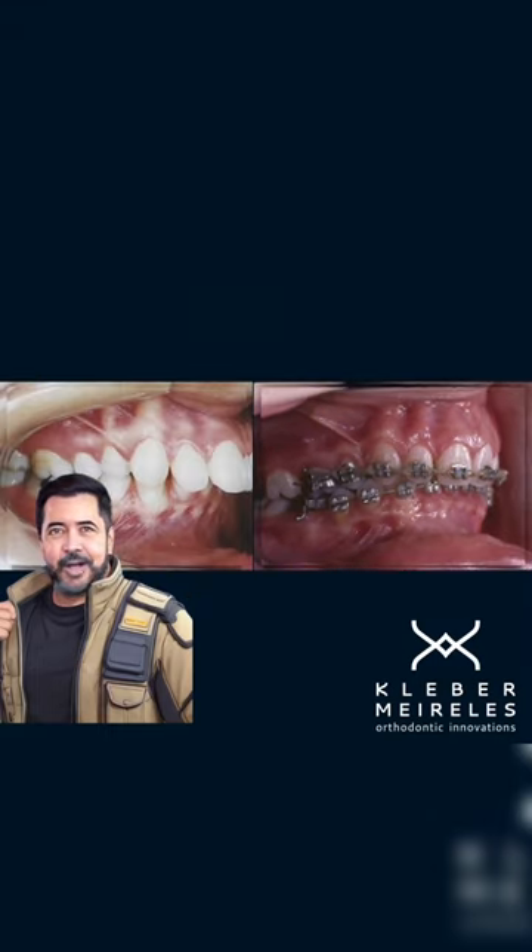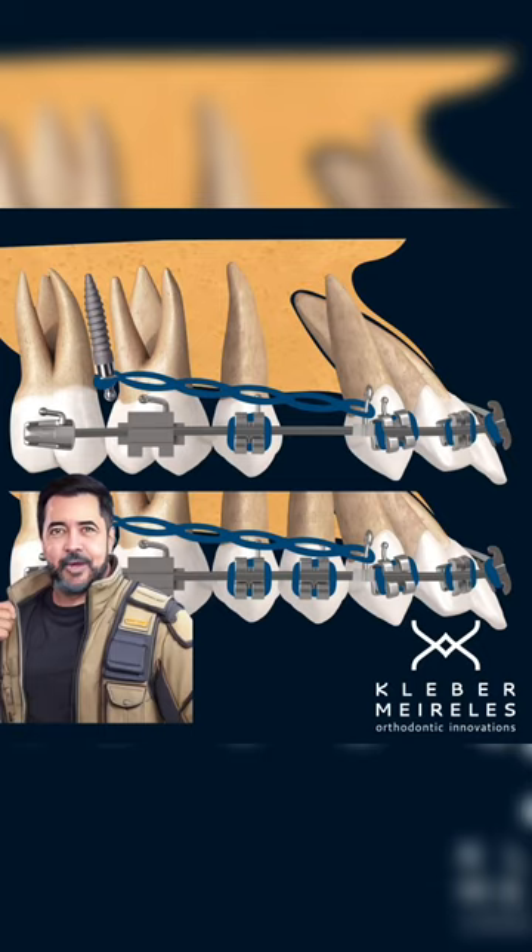When comparing the before and after, you can clearly see the roller coaster effect. There is no magic in orthodontics — everything must be based on controlling the biomechanics using the right strategy.